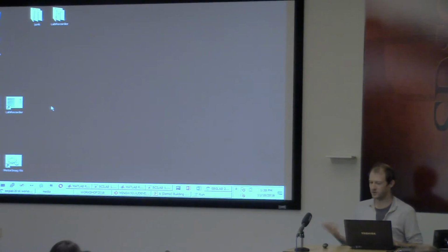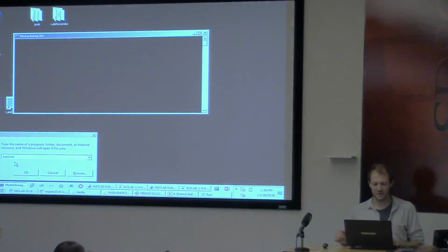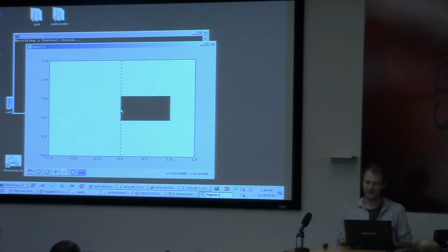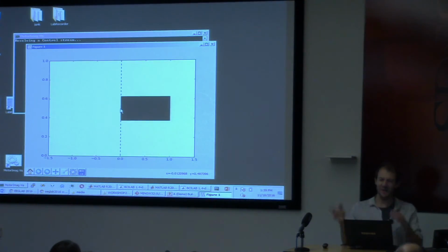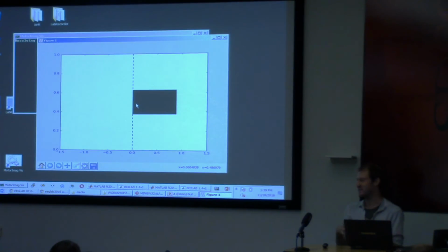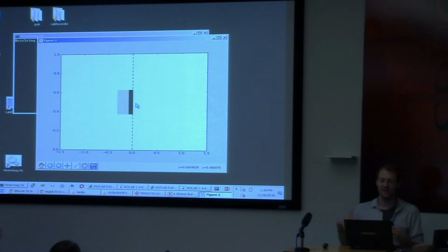Now I can start an external application, say a game, which picks up these data. And so I start this one. Pretend that this is a fancy spaceship that's banking left and right. So this here is a very simple demo that just shows a bar that extends to the left if you're imagining left hand, extends to the right.